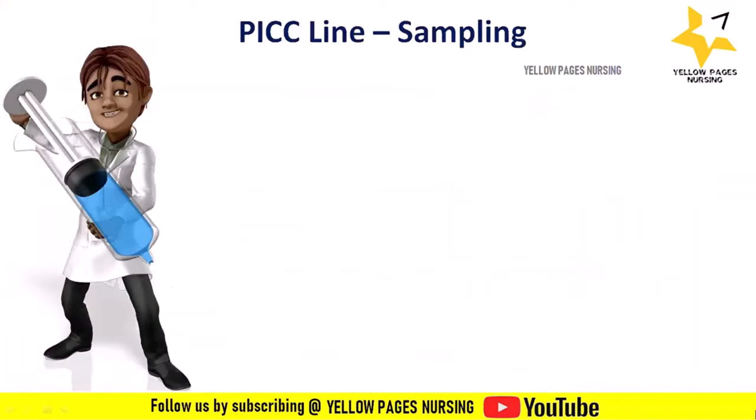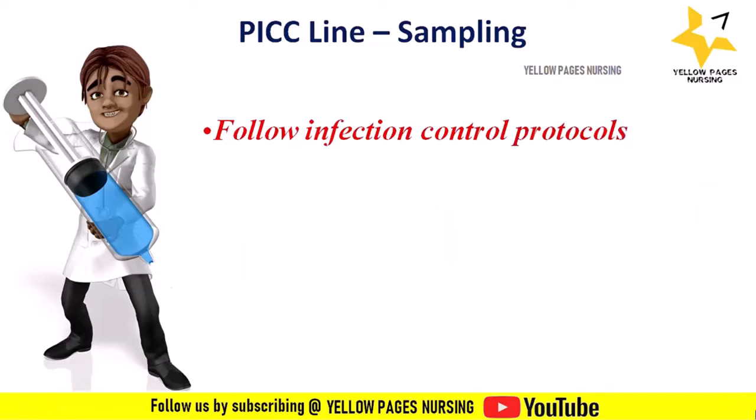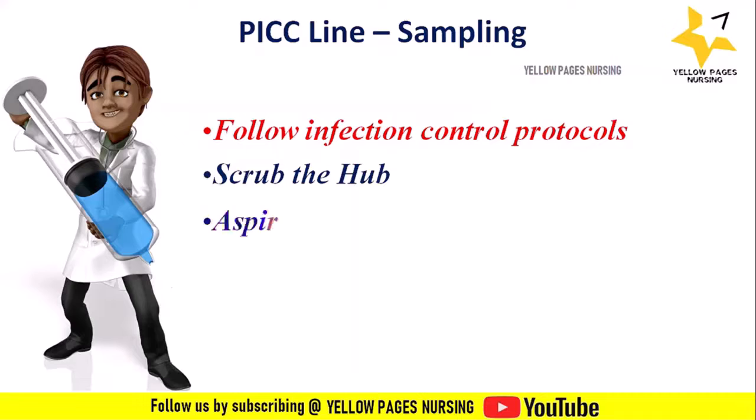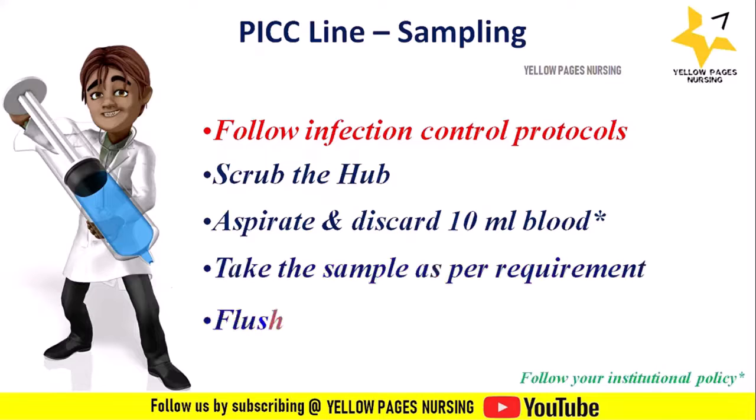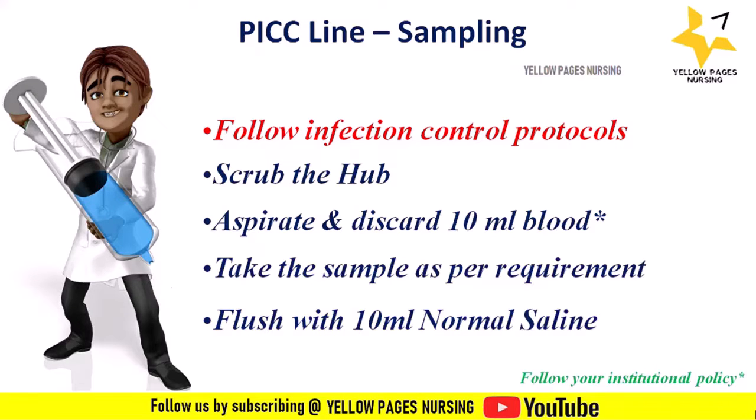Next comes sampling from the PICC line. Follow infection control protocols. Scrub the hub with 70% alcohol, that is isopropyl alcohol. Scrub the hub for 15 seconds and allow it to dry for 15 seconds. Discard 10 ml of blood. Take the sample as per the requirement and then finally flush with 10 ml normal saline.